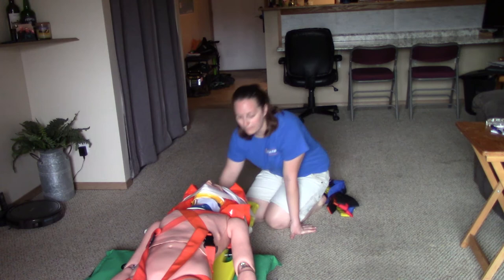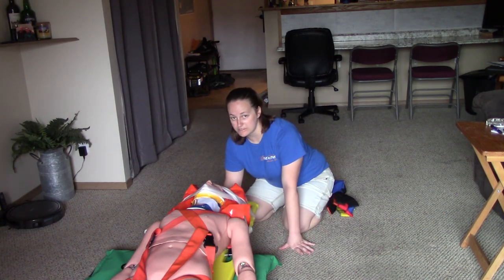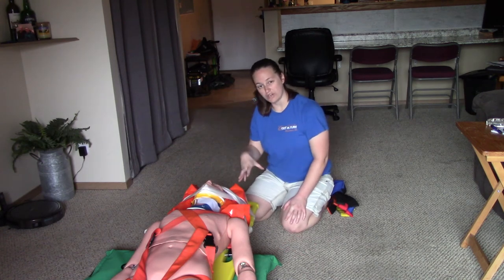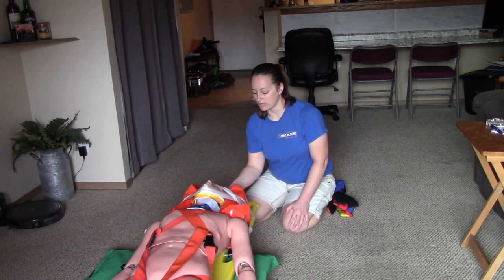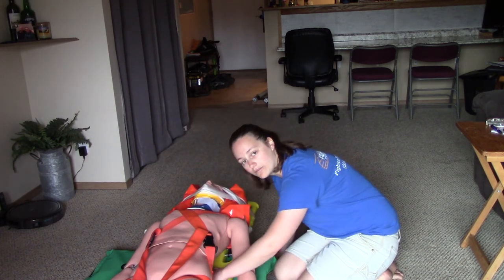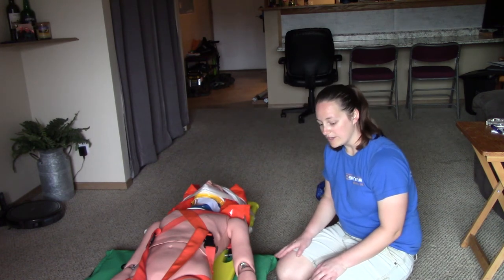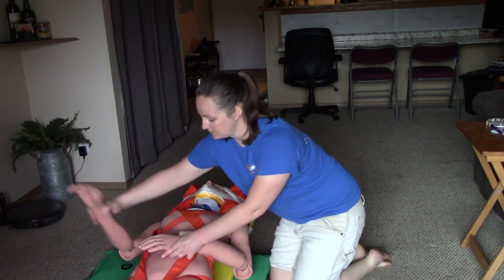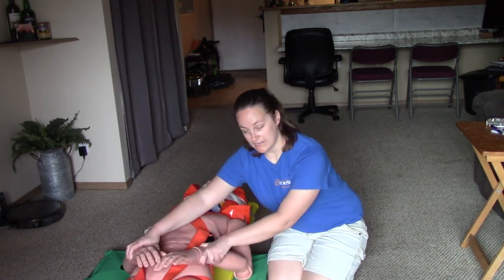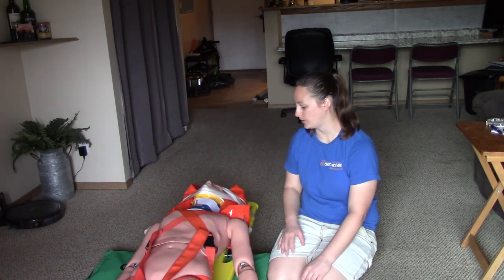Patients get extremely uncomfortable on a backboard, so we'll add padding to the most uncomfortable areas: behind the occiput at the back of the head, where the tape pushes the head down onto hard plastic; under the small of the back where there's a natural gap; and under the knees for support. If my patient is conscious I'll ask them to cross their arms over their chest so we don't catch their arms in a doorway while carrying them. If they're unresponsive, I'll tape their thumbs together — that's enough to keep their arms from falling to the side, and if they wake up they can easily rip that apart without feeling tied down.